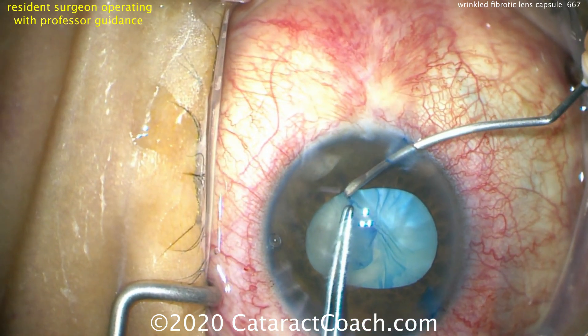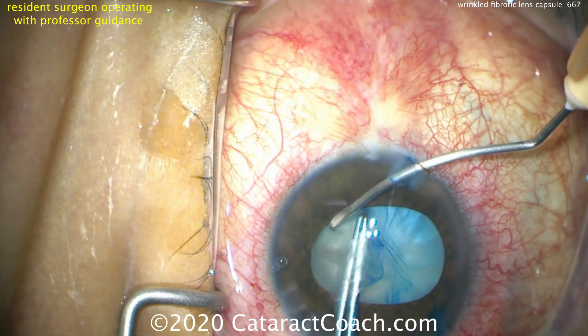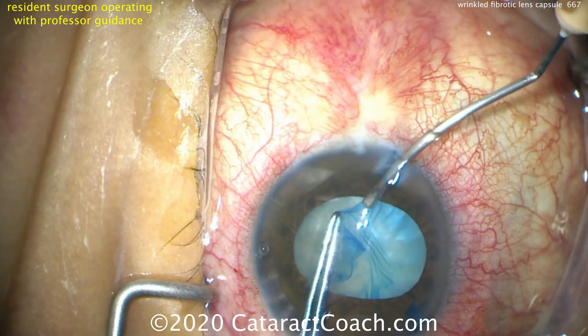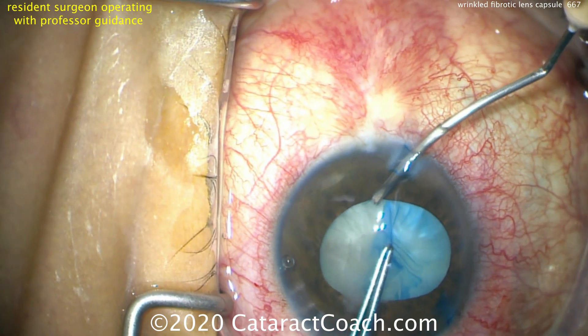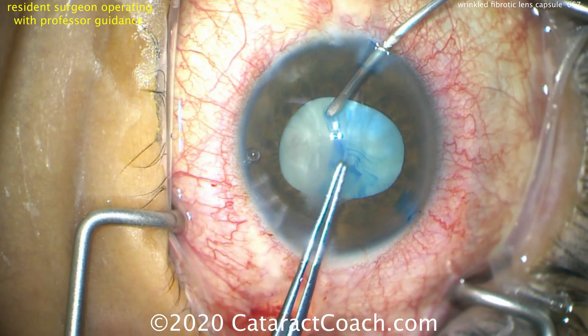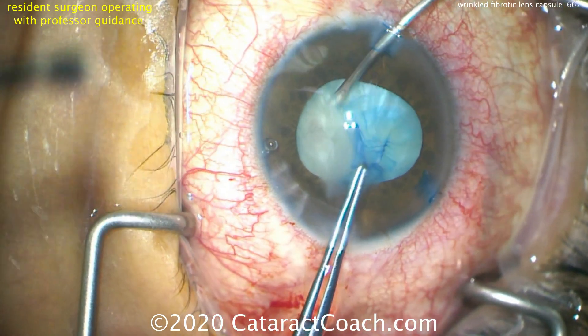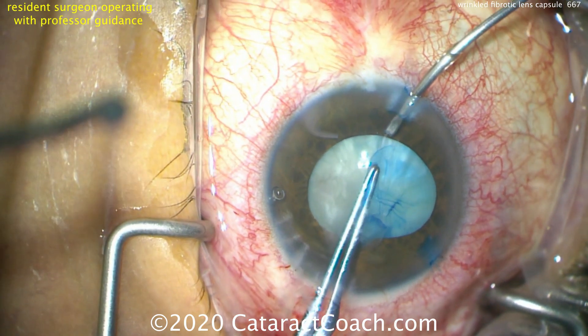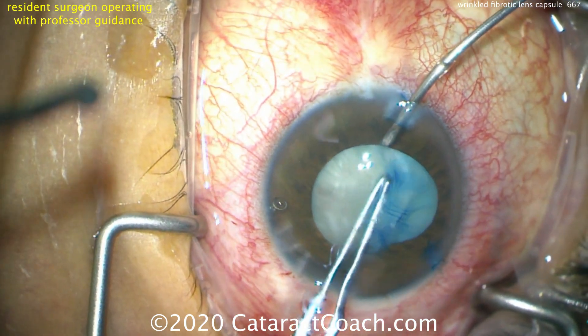Now it got stuck again on that band, so we'll use with one hand the forceps, and in the other hand we're using a cystitome or a bent needle to make a little cut here to help continue this capsulorhexis. We have to be careful doing this and it takes a few tries to break through that band, but once we do we can re-grab and now continue our capsulorhexis.